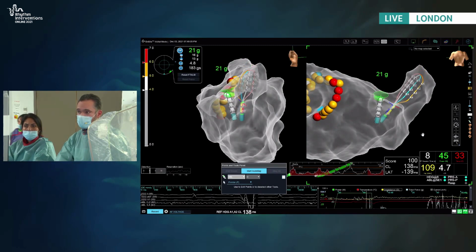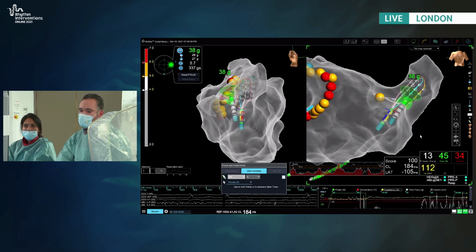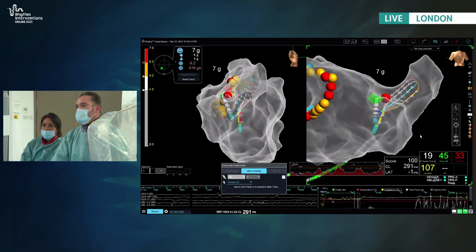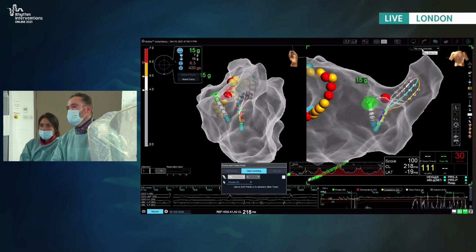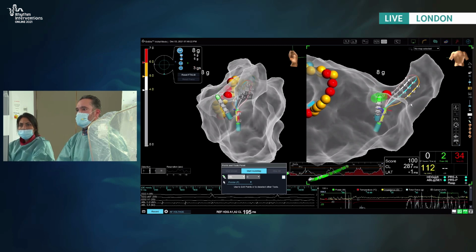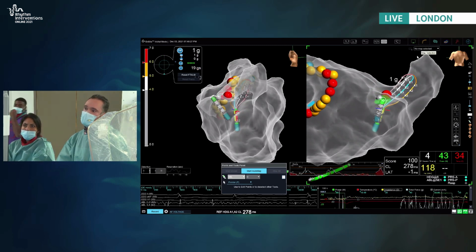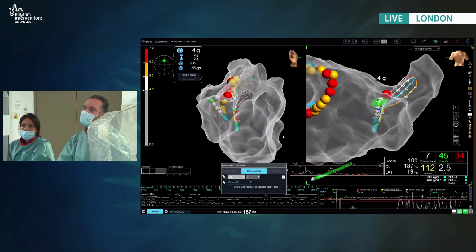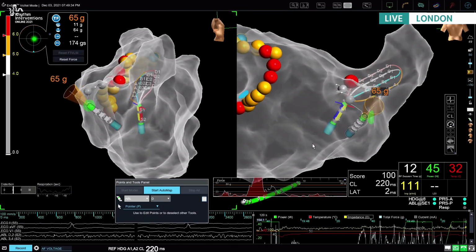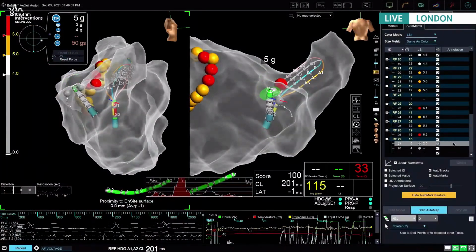So I mean, the grid's an ideal catheter for that sort of thing. I suppose partly because of the nice clear signals that you tend to get with it, but also it meshes very well with the omnipolar mapping and establishing directions. And I suppose what the company pushes is true: the bipolar blindness, as they've been calling it. The size of electrograms and directionality are very much affected by which way they're moving, sorry, relative to the bipole.